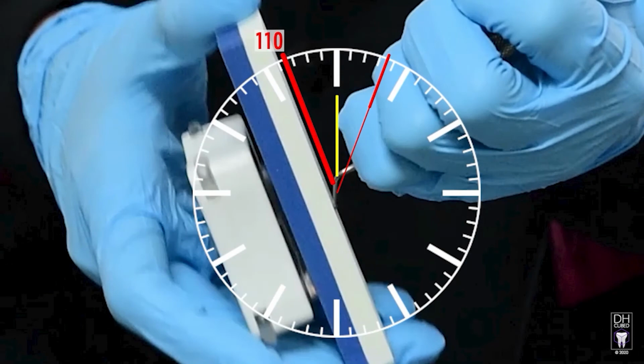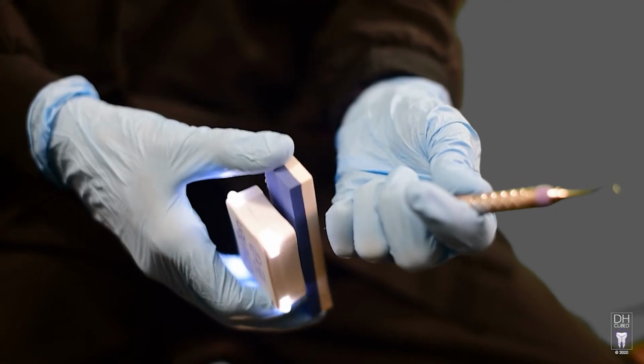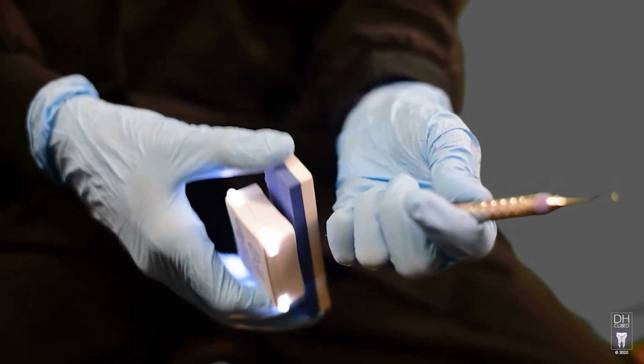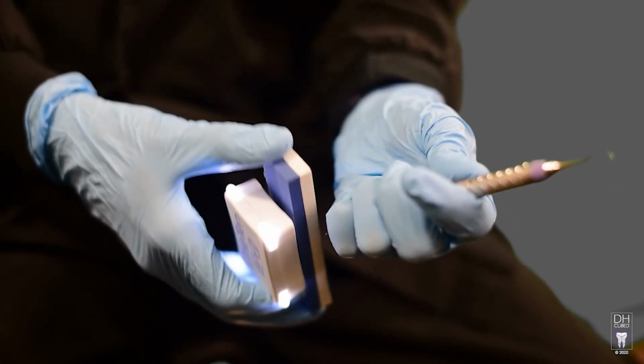Maintain the 110 degrees as you move towards the tip of the sickle scaler. Do not turn the stone in towards the tip as you approach it. This will cause the tip to get thin and possibly break off. Or the tip will become short and not be able to adapt far enough into the interproximal, therefore missing calculus. This is why you want to maintain a straight path along the entire length of the blade, from shank to tip. The tip of the sickle should never be sharpened.